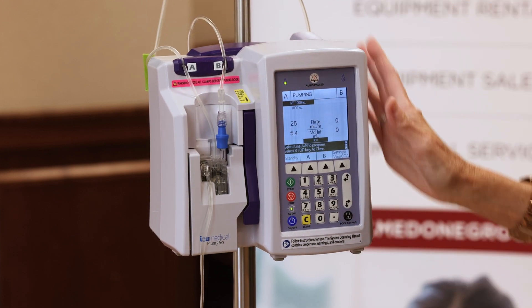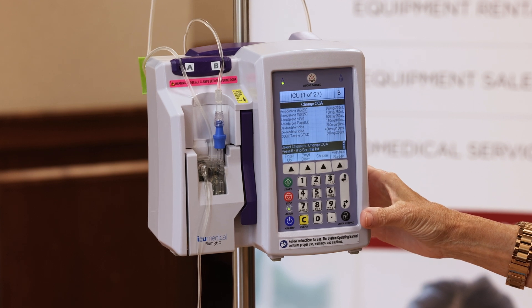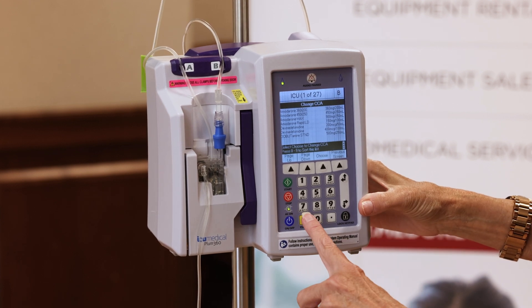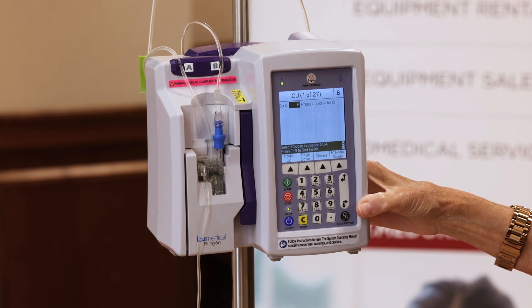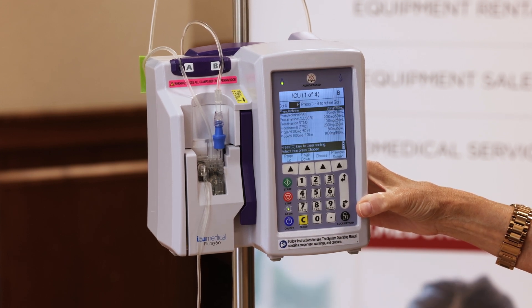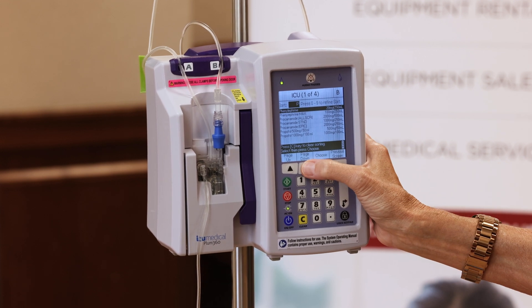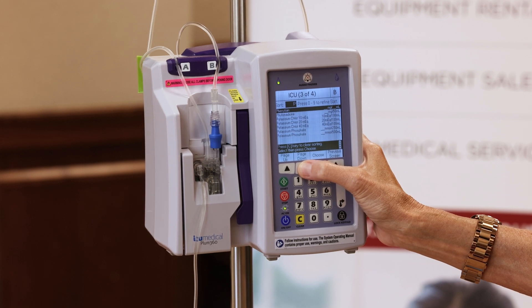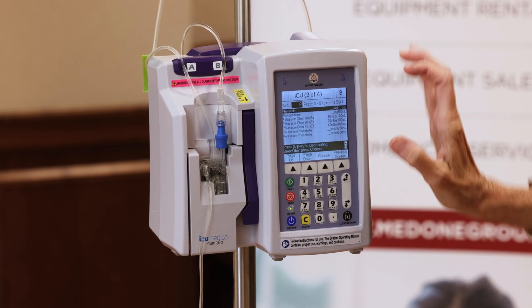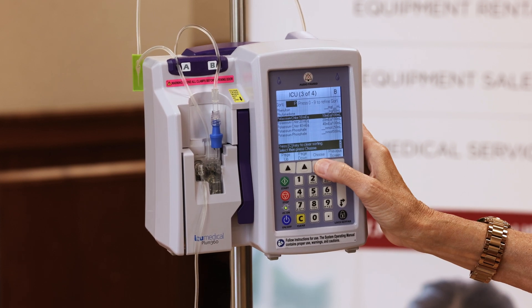Now I'm going to choose B with my soft key, and I'm looking for potassium. It's seven, and it's the first letter, so I'm going to hit that one time for the P drugs to come up. I'm looking for potassium, so I'll page down — page down one more time — and here's all my potassium. I'm going to select down to my 10 MEQs and choose.